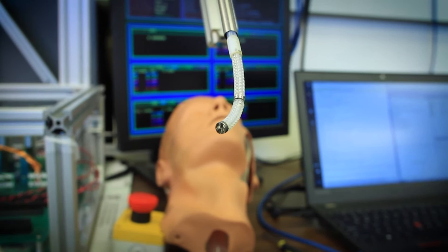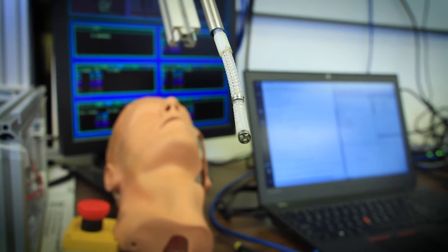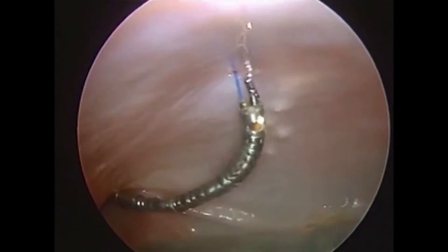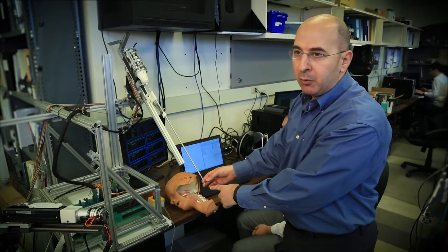Saman says his flexible robot would go through the nose, bypassing a gag reflex in the throat. This device here has three working lumens, which can deploy a laser, a gripper, a suction tool to help achieve micro-surgical tasks.